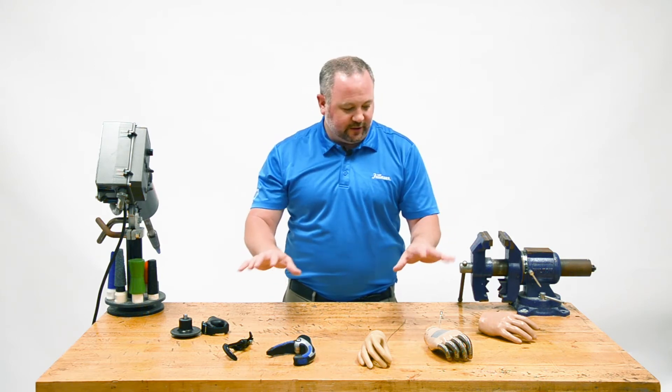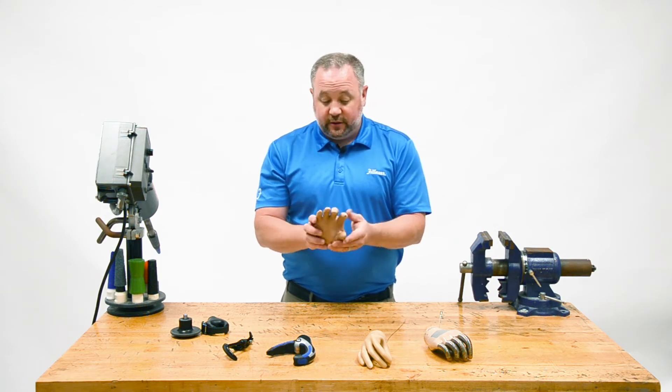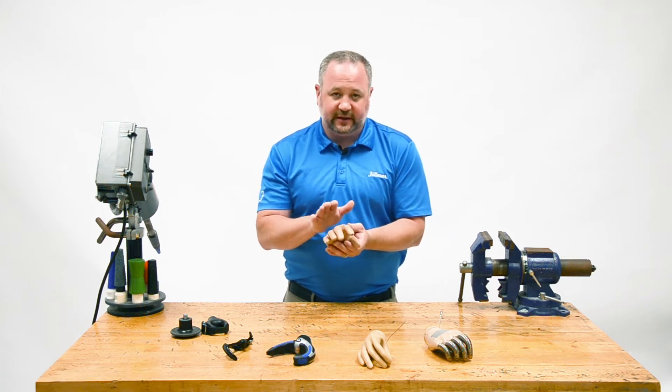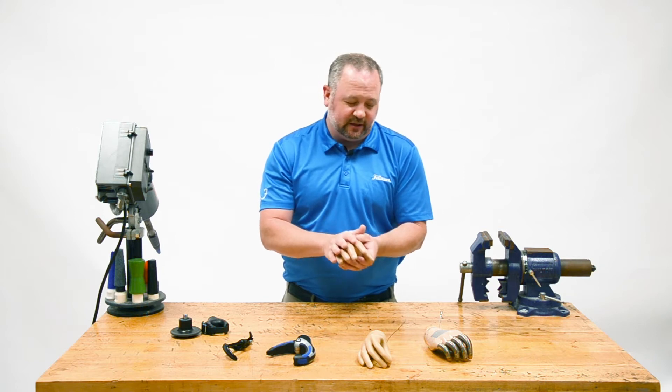Just so you know what's out there as far as body power: we have passive hands, which are a really good option for those people who are looking for something that's cosmetic. We'll talk in detail about how to select not only the hand but the gloves so that you get the appropriate size and color.